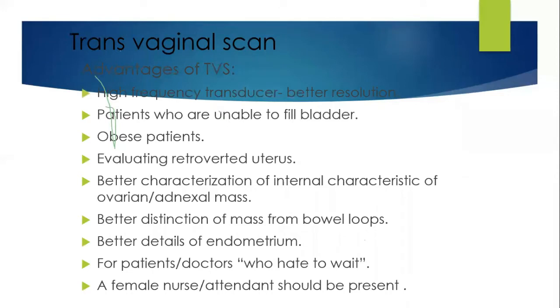Now we will move ahead towards the transvaginal scan, because remember this, unless there are some large myomas or ovarian cysts so large that we are not able to take their exact measurements with a transvaginal ultrasound, we are actually required to learn transvaginal scan for all gynae purposes. So all those sonologists and gynecologists who are with us today should know that the transvaginal scan is something we all should learn: how to use it and how to interpret the normal anatomy in the transvaginal scan.